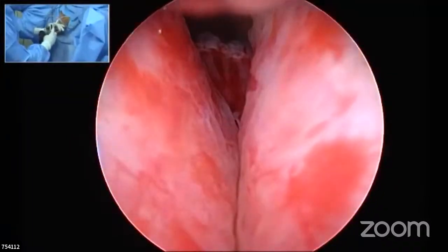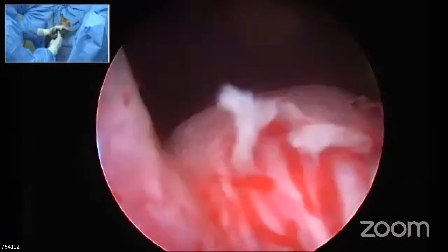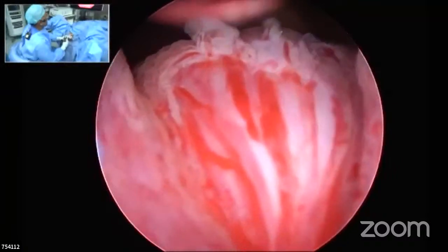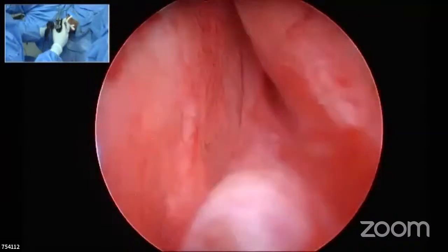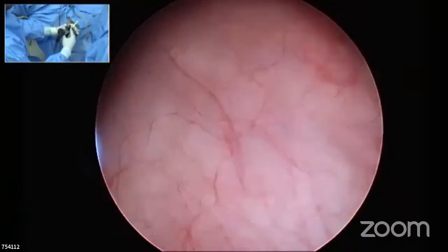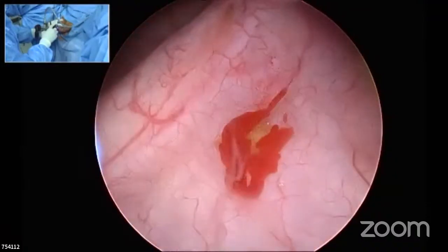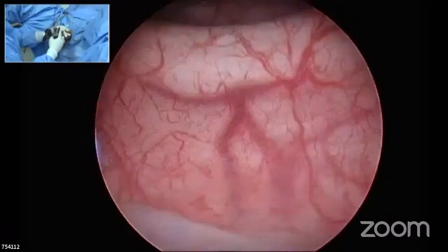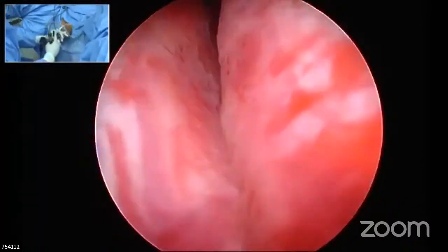When do you do a pre-op urodynamic study for patients when you're taking them up for prostate surgery? Patients with chronic urinary retention, patients with voiding symptoms with more than 15 to 20 years of diabetes mellitus, we always do a urodynamic study. I don't say that I will negate a TUR or a HoLEP in a patient with low voiding pressures. No. But I would certainly know the chance of recovery, how it will be, I can predict. So this has been our protocol to do urodynamics in these two scenarios.